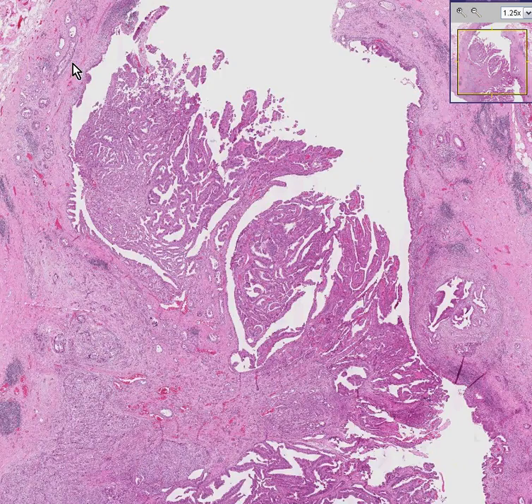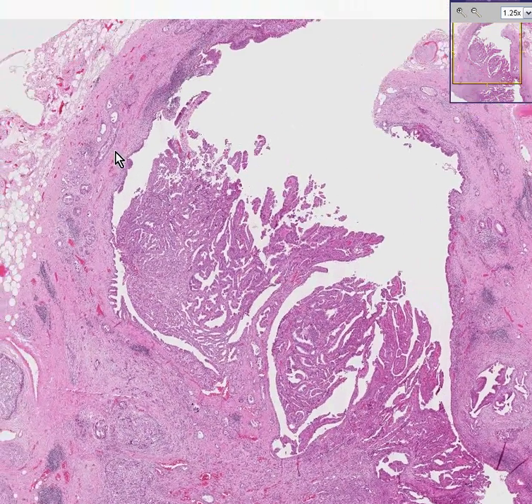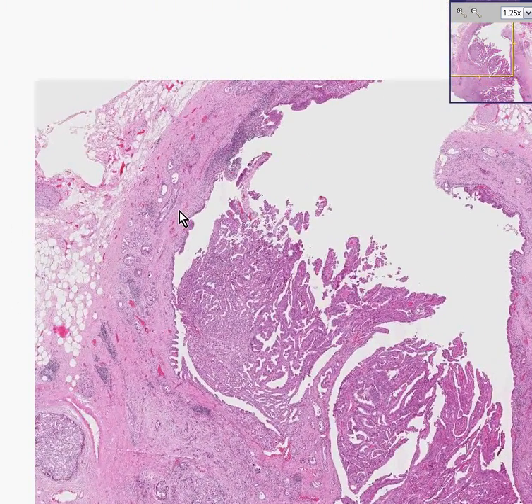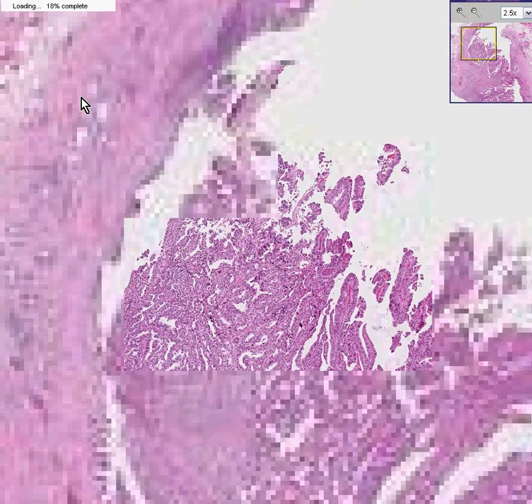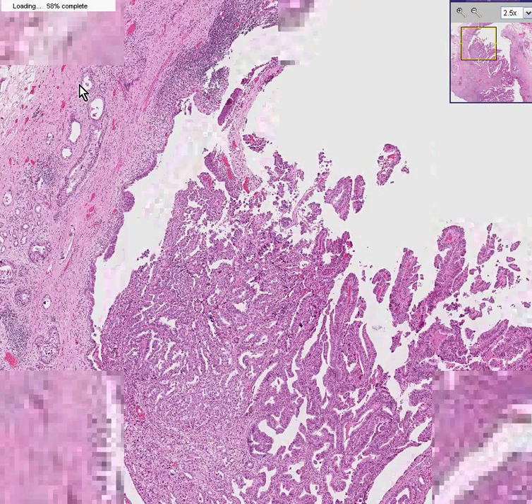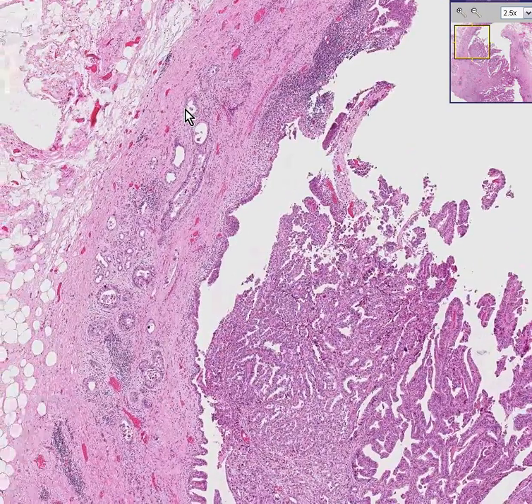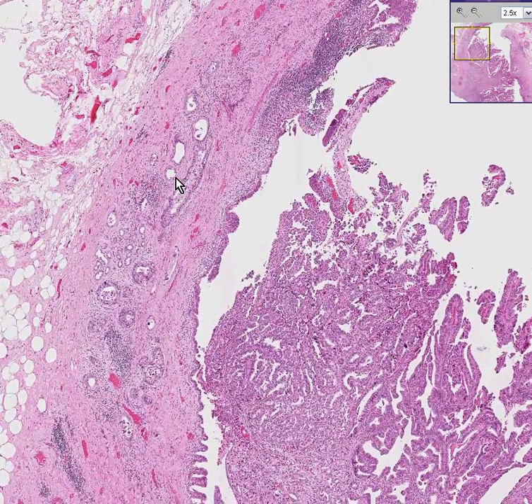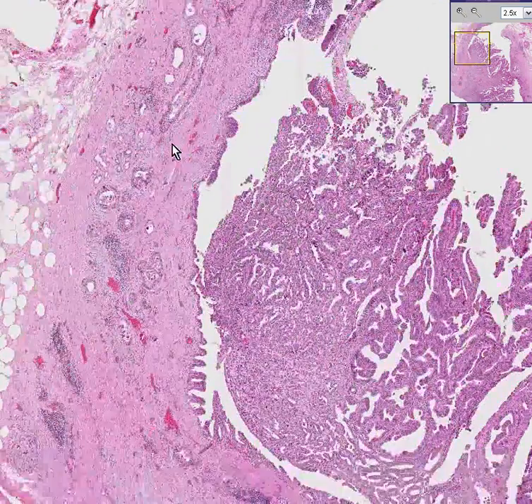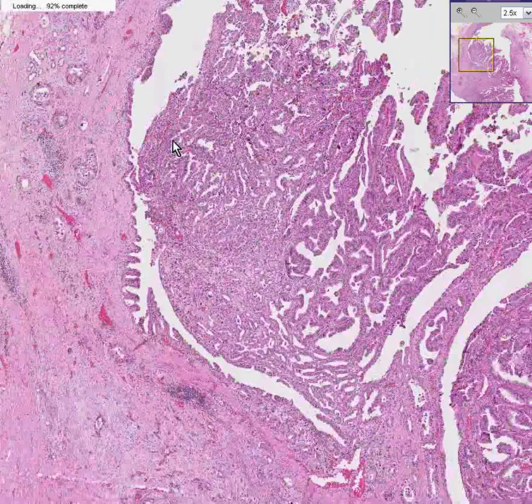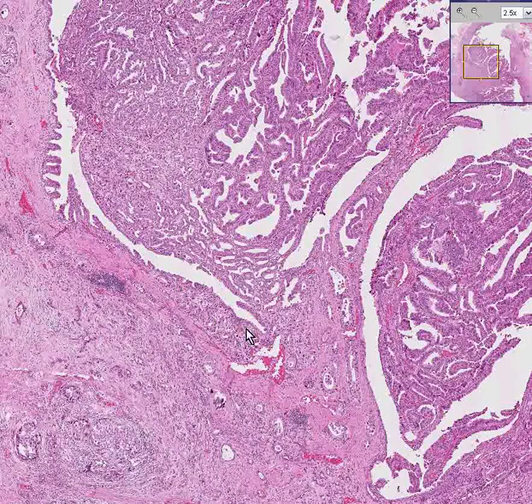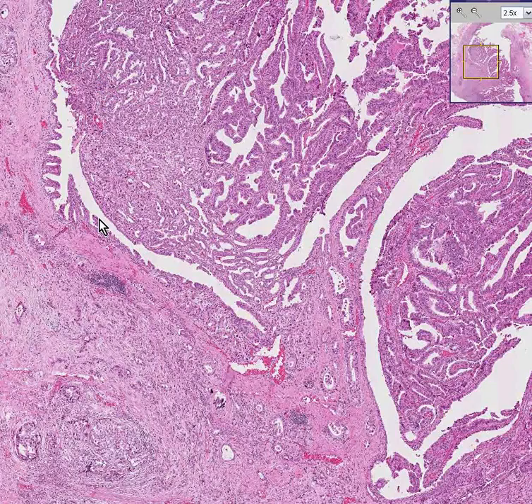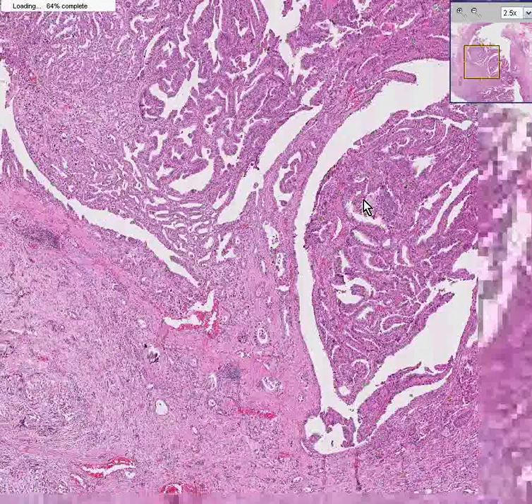It looks like it could be a common bile duct, and maybe that's why they named it common bile duct. The reason why this is a rare thing is because we are privileged to see that on the inside of this duct, apparently originating from the mucosa of this duct, is a large tumor.